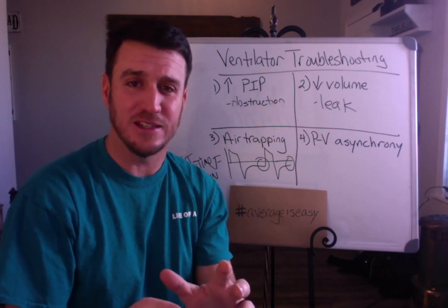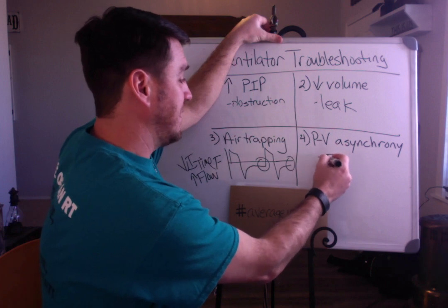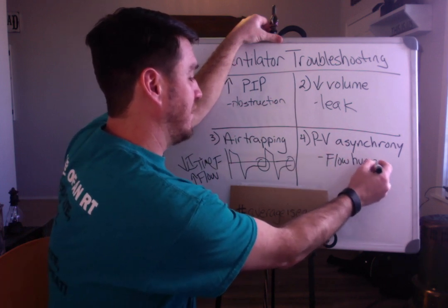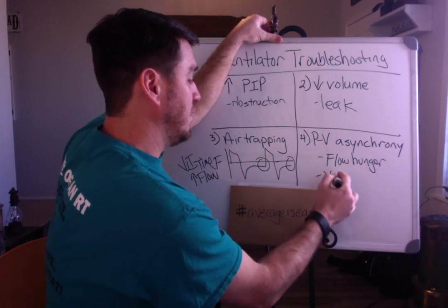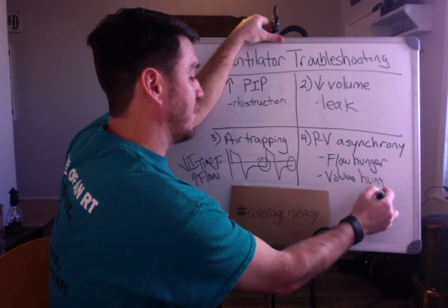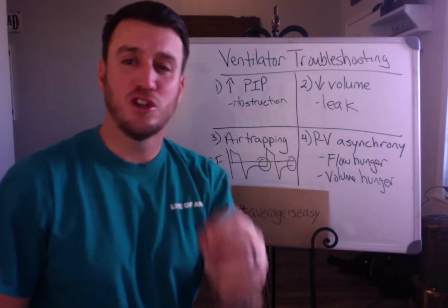Various things can lead to this, but I'm going to give you two of the most common. It can be one, that they are flow hungry, or two, they are volume hungry. Those are the two most common.